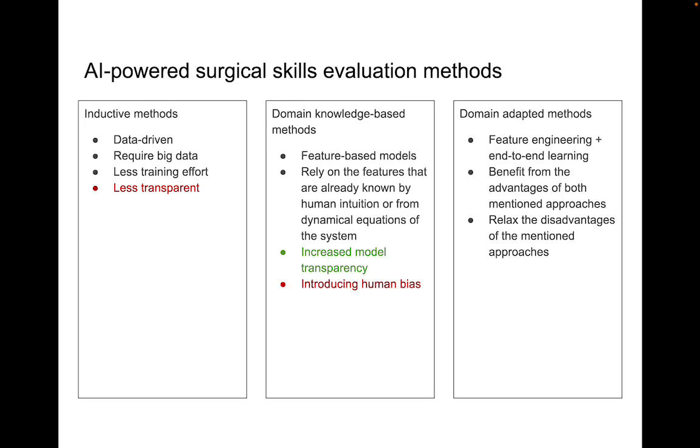AI-powered surgical skills evaluation methods fall into three main groups. In inductive methods, feature extraction, model structure, and hyperparameters are mostly determined by the input data, which is usually big data. This will reduce the training effort at the cost of losing the model's transparency.